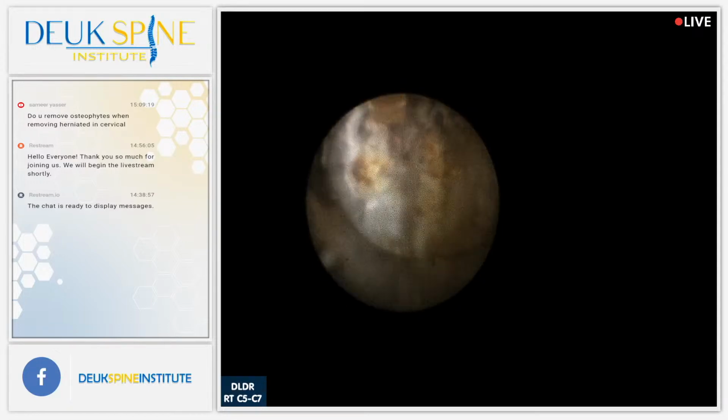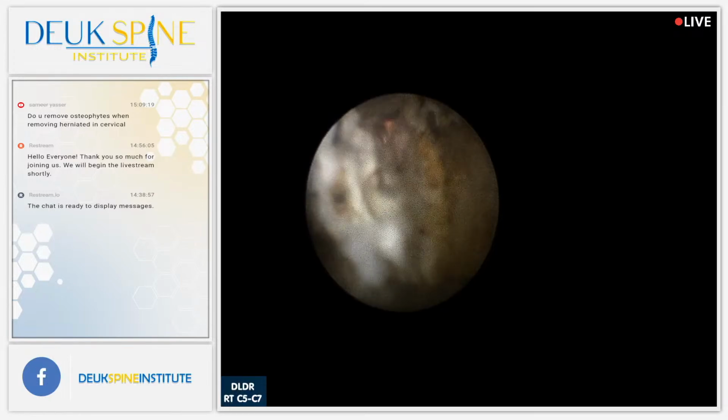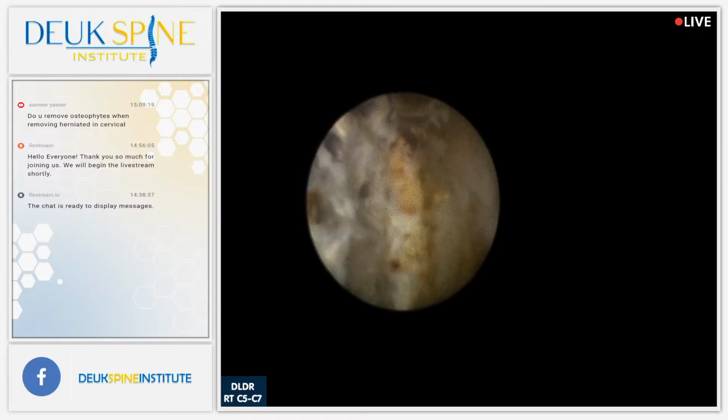Definitely has a little bit of ossification of the posterior ligament. You can see it there. Let's go back out the foramen.